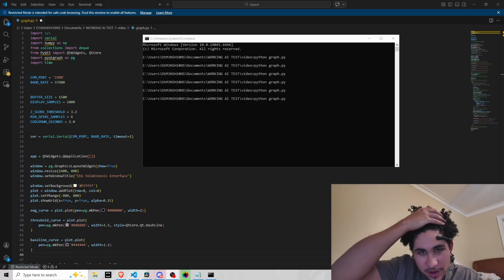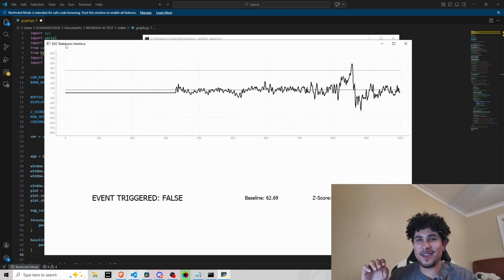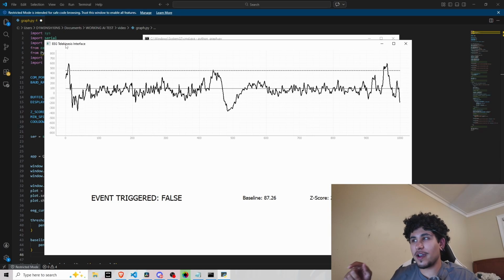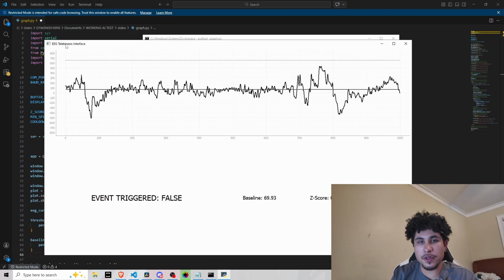Okay, so I'm wearing the headset. Once I run this Python code I made, it should show my brainwaves scrolling on a graph. So let me just run this code. That's freaking sick. Okay, basically this graph shows the raw electrical values that this electrode is picking up.